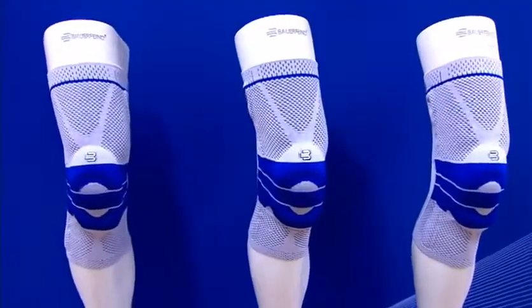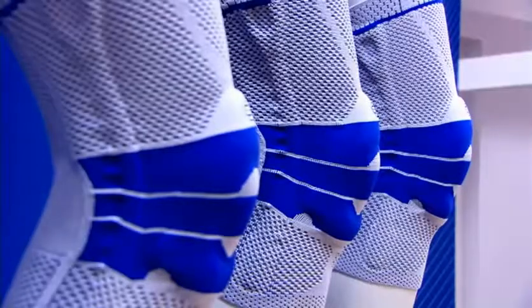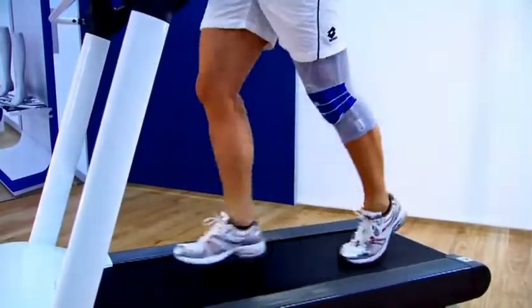The Genutrain from Bauerfeind stabilizes the knee joint, relieves joint pain, and boosts the sensory motor system and mobility. The medical effect of the active support is produced by the interaction between the anatomical contoured Omega Pad and the three-dimensional Train Active Knit.